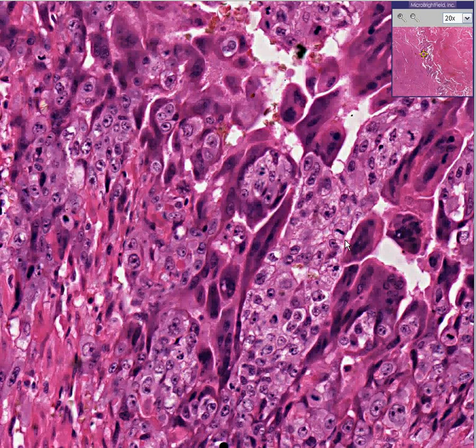Only in this case, they've gone wild — they're invasive. They could kill the patient.